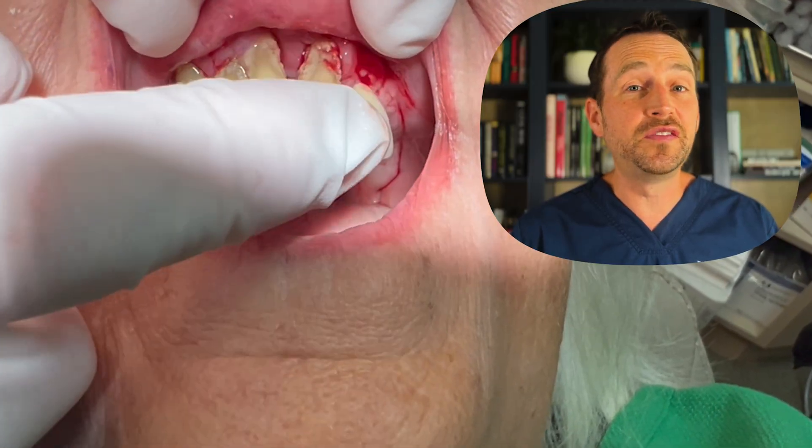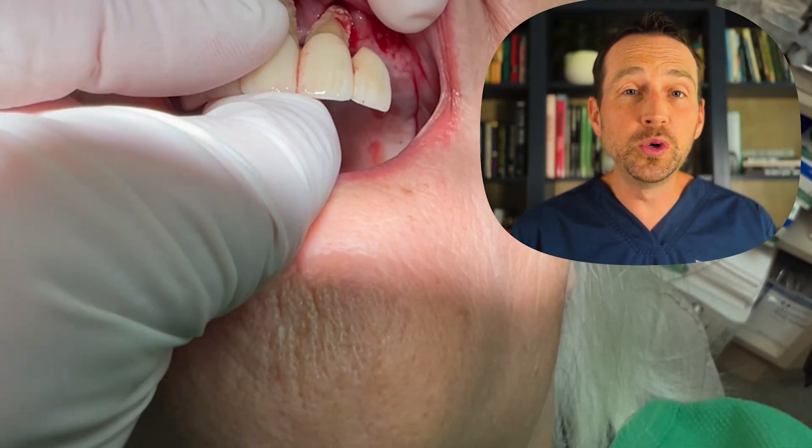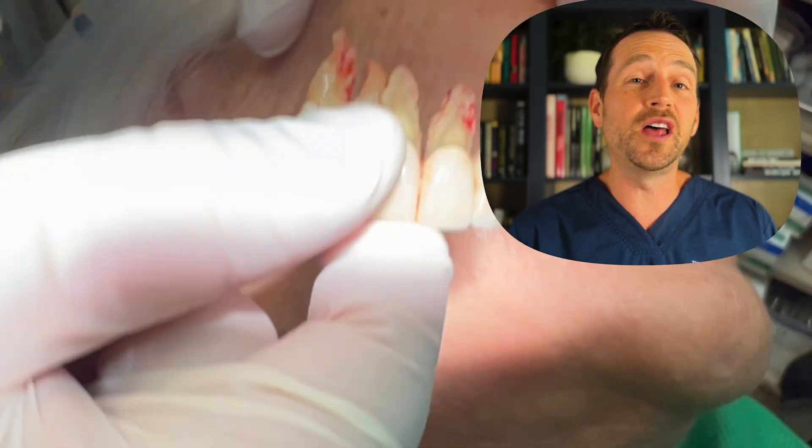These teeth are connected via a bridge, and there's so much bone and soft tissue loss that I'm able to remove them simultaneously using nothing but my fingers.